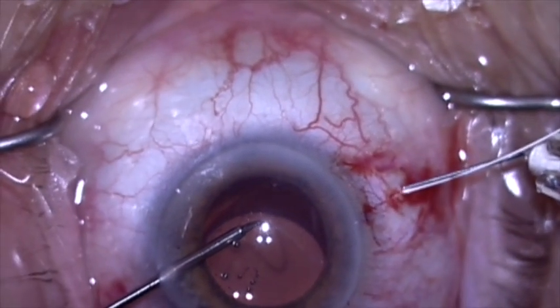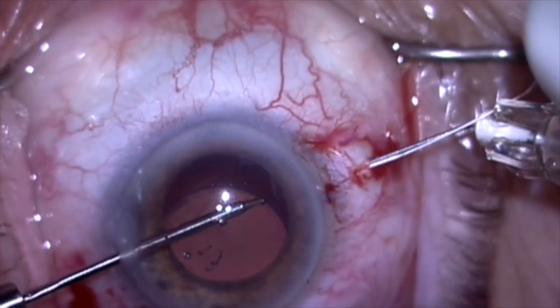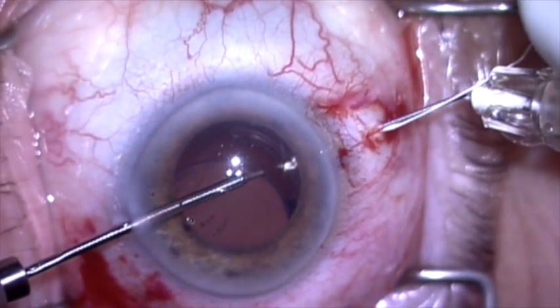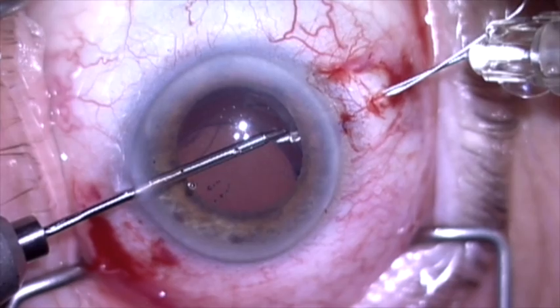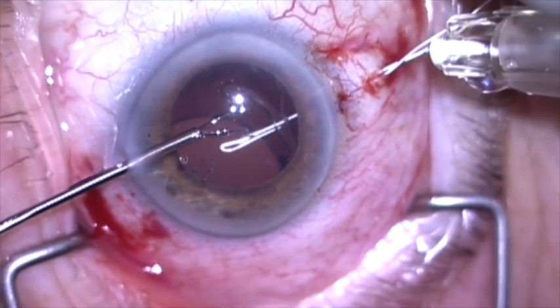The 30 gauge needle is now going to be passed through the capsular bag from underneath, between the haptic and the lens optic, and it's going to carry the suture through the capsular bag. This is a very gentle, atraumatic way of doing this.